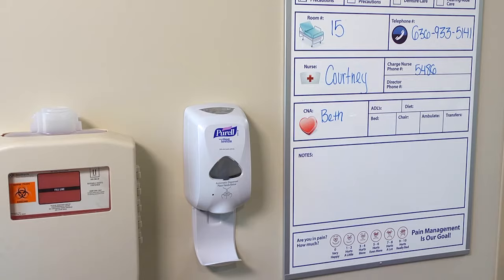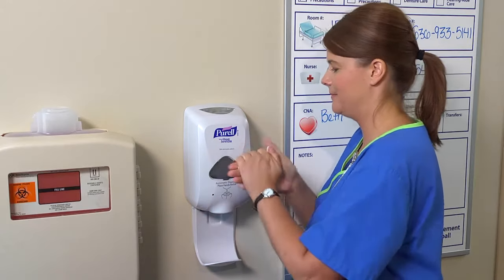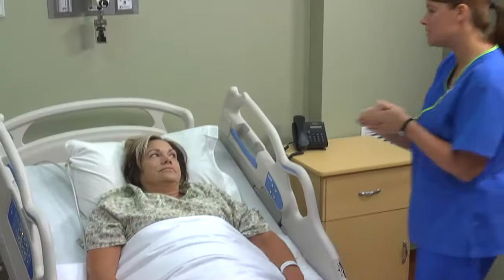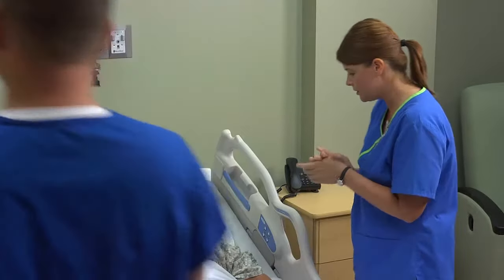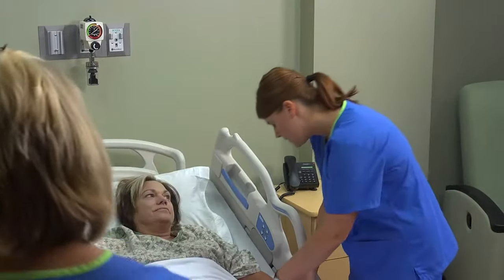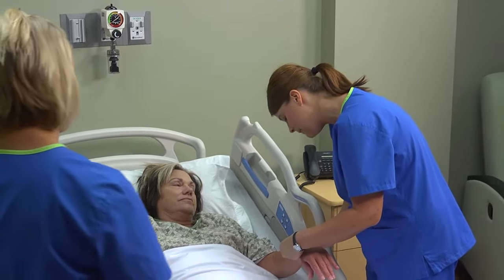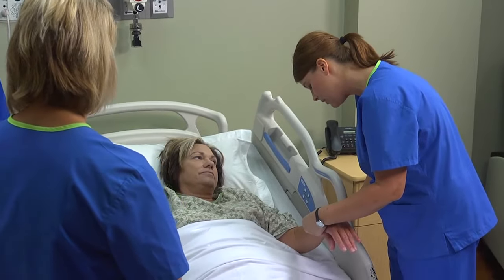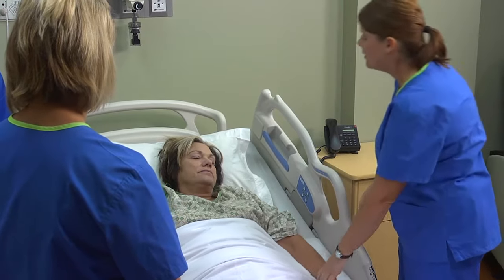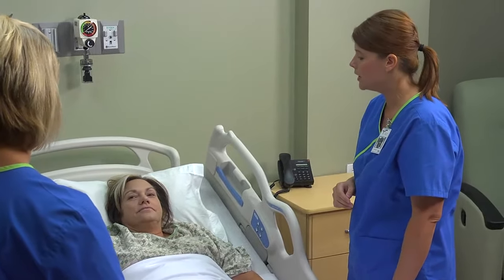After performing hand hygiene and ensuring privacy, introduce yourself to the patient. Then identify the patient using two identifiers. Check the name band and ask: 'Can you tell me your first and last name?' — 'Sue Reed.' — 'And your date of birth?' — '5-23-55.' We've got Dieter and Teresa here to help us transfer you.